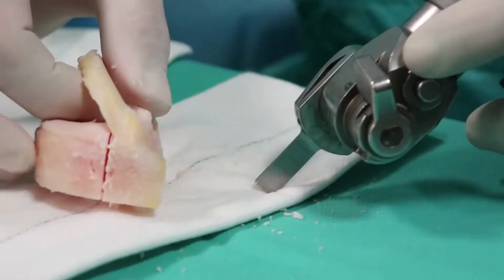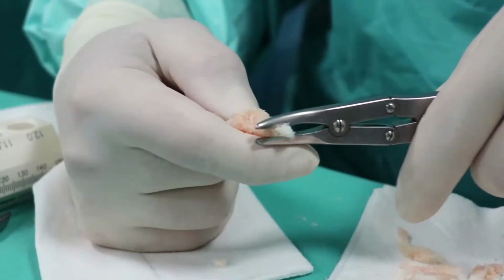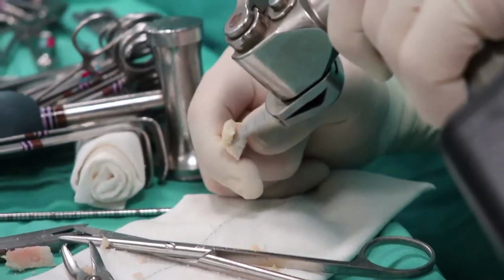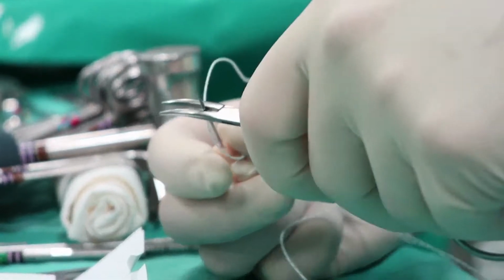In this video, we present the case of a 45-year-old male with left knee medial post-meniscectomy syndrome. Indication for medial meniscal transplant was discussed with the patient. Our treatment of choice is an arthroscopic fresh frozen meniscal transplant with bone plugs.